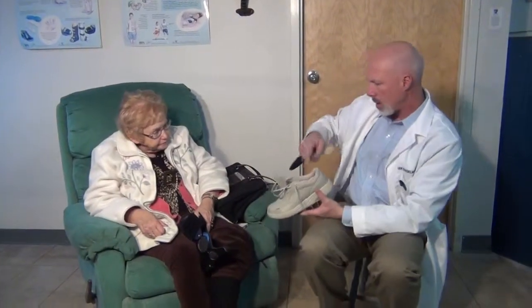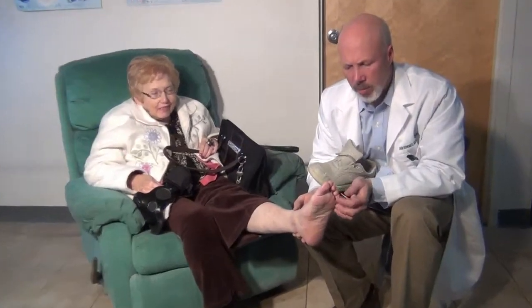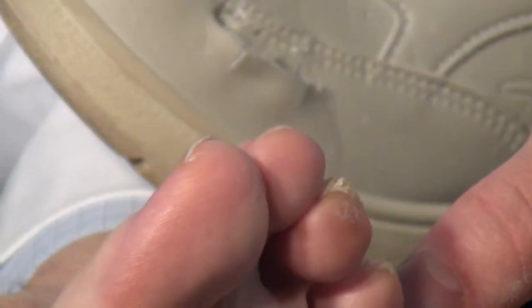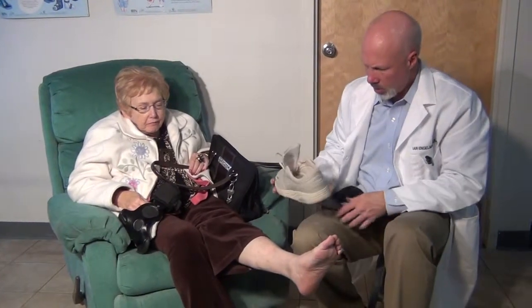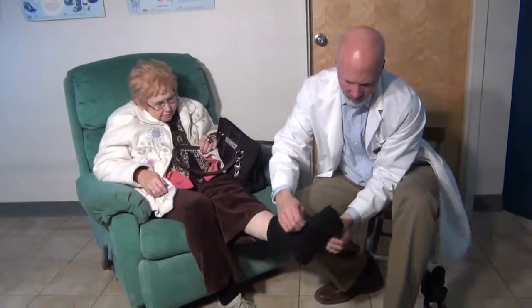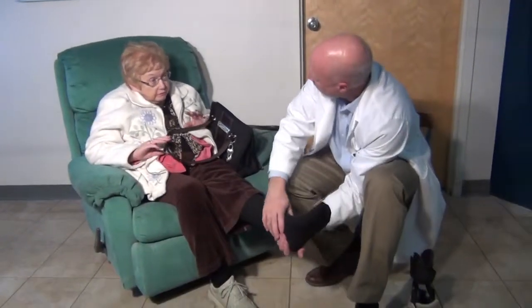Alright, so now I'm going to take a tool and get down there and create a relief for you. This is the spot right here of concern — the very distal end of her third toe — and that's really pushing hard down into the bottom of this shoe. So we created a relief in the plantar surface of the shoe for that spot. It said so on the literature — oh good, you read our instructions. Way to go.